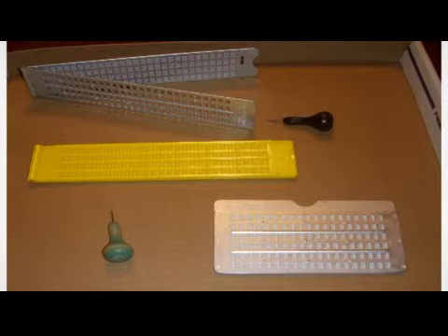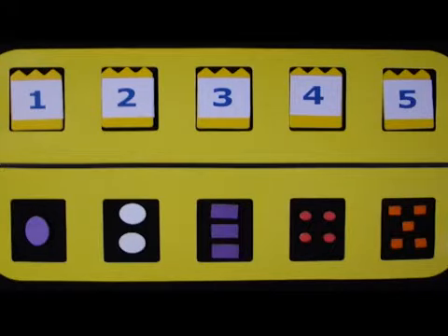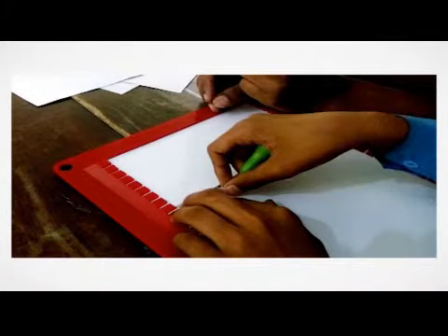In the use of slate and stylus, the user places a sheet of paper over the lower strip, closes the upper strip and presses it into place. The tip of the stylus is then pressed down through the small rectangular hole to make Braille dots or cells. The process requires the user to punch the Braille dots in reverse order, that is, right to left, so that it can be read from left to right.